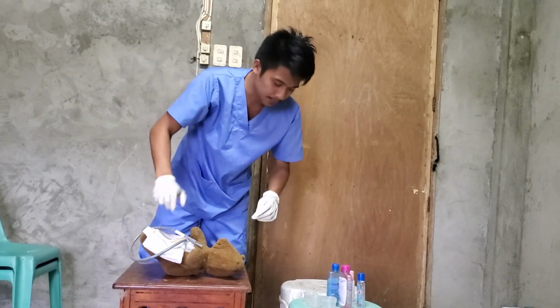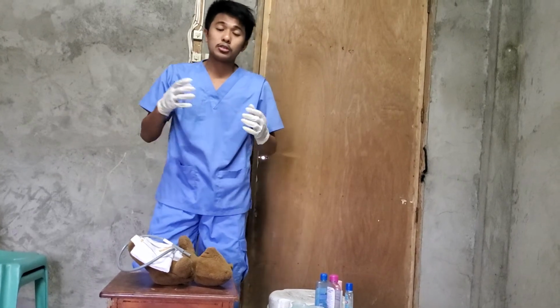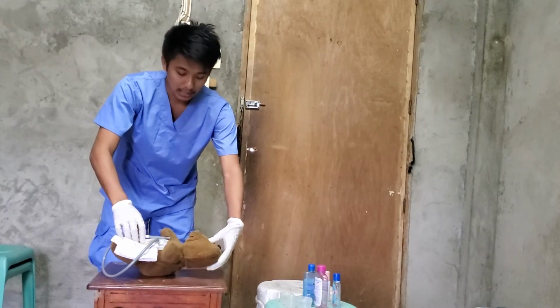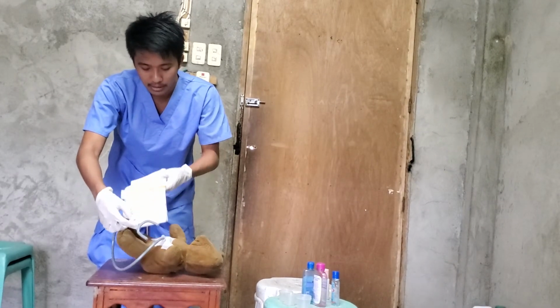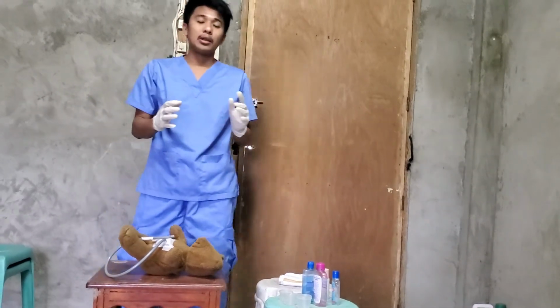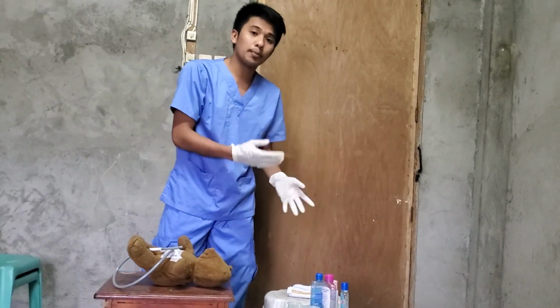Then after the administration of medication, the next step that you need to do is to position the patient comfortably, with the head elevated on the bed. Then remove the towel. Then after removing the towel, next step is to dispose of soiled supplies into the appropriate receptacle.